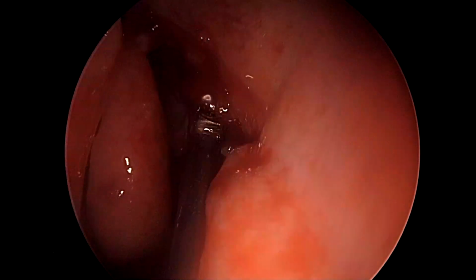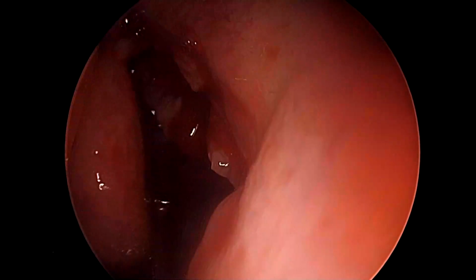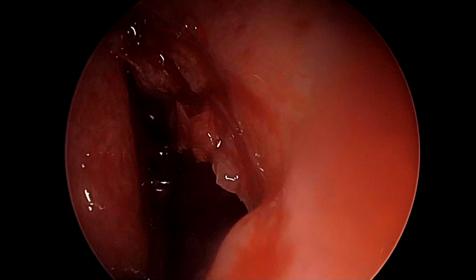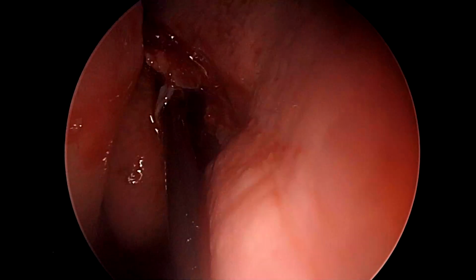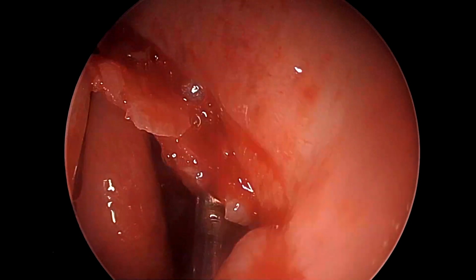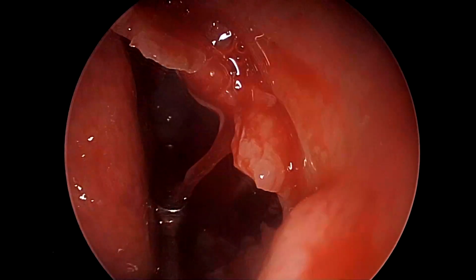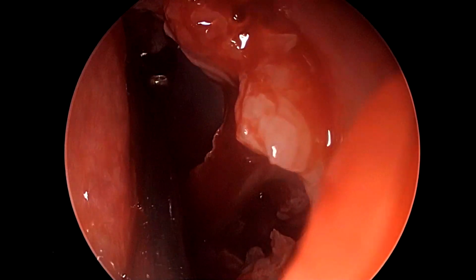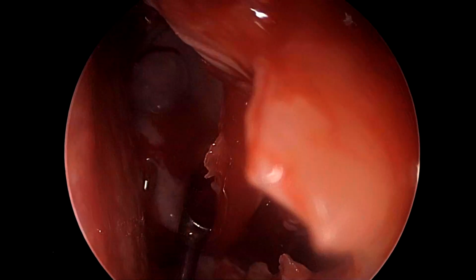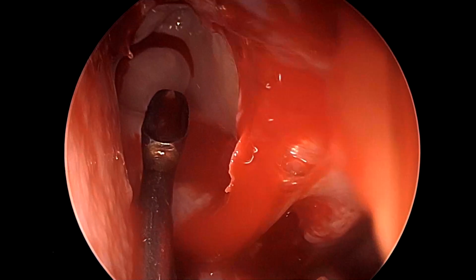And we use the same 45-degree, or a frontal sinus curette, or a ball probe, to back fracture the anterior ethmoidal cell, that is the bulla ethmoidalis. Resecting it with a back fracture is always the safest way of removing it. When you try to use a Blakesley forceps, you can actually injure.